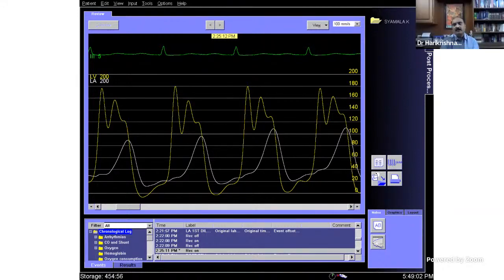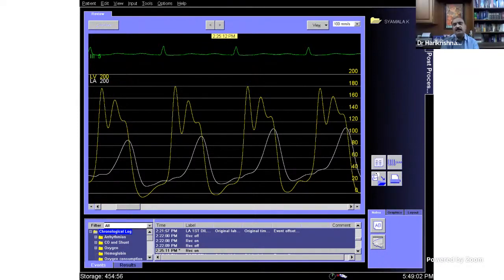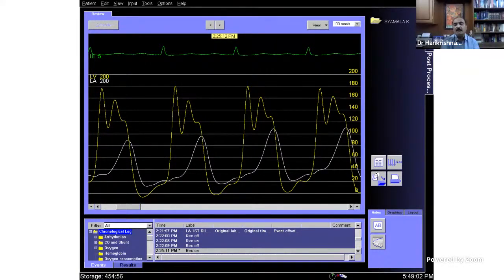Okay. So acute MR. Usually when there is a severe MR, a post-valve tear, there will mostly be no gradient across the valve. Significant gradient may not be there across the valve. The V wave will be very, very prominent. You can see the V wave. No, it has gone above 100. Yes. So how come the pressure is still the same, sir? If there is a severe MR, the systolic pressure has not dropped that much. No, it's acute, very acute. This is just immediately after the BMV. You will not find the pressure drop immediately. See the V wave, it has gone above 100.